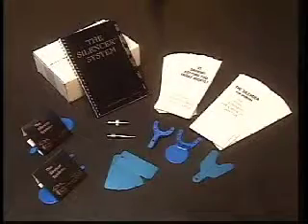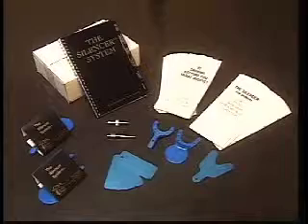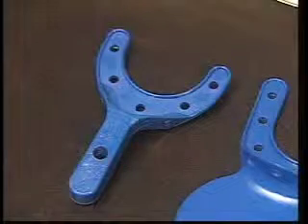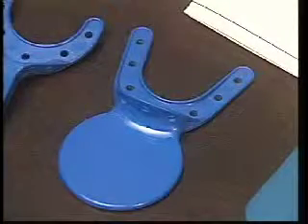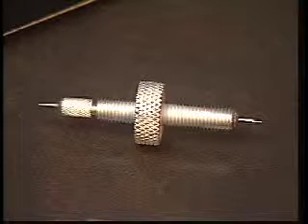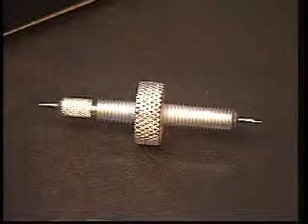The silencer kit comes complete with the patented Gothic arch tracer. Components of the Gothic arch tracer are the upper or maxillary clutch with a threaded hole for the tracing and positioning stylus, the lower or mandibular clutch with a mandibular tracing plate, and a threaded double-ended stylus. One end has a drafting lead, the other end has a spring-loaded positioning stylus.